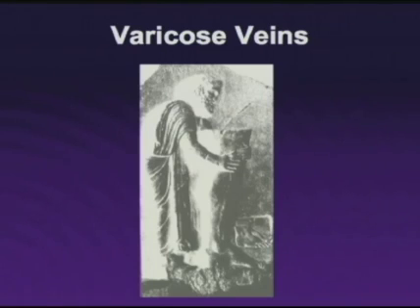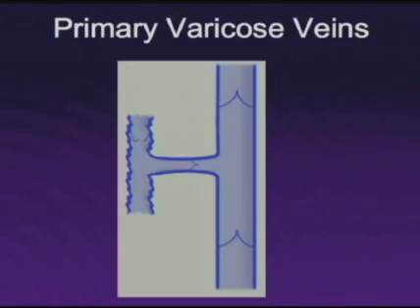I'd like to go and just talk a little bit now about chronic venous disease, of which the most common condition is varicose veins. This has become increasingly of greater interest because of the treatment options for varicose veins that are becoming more widespread, namely endovascular laser or radiofrequency ablation of these varicose veins.